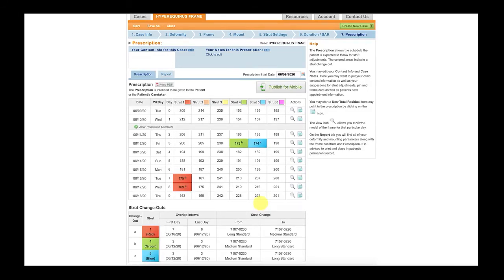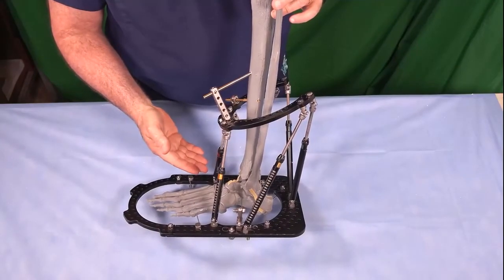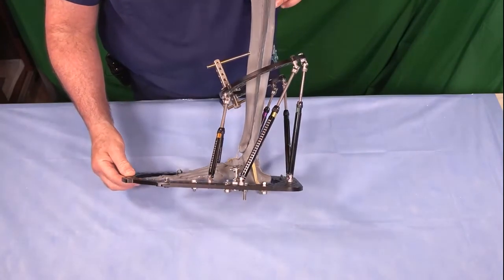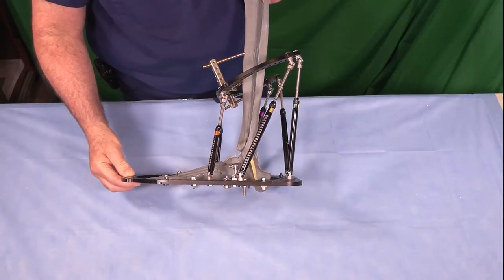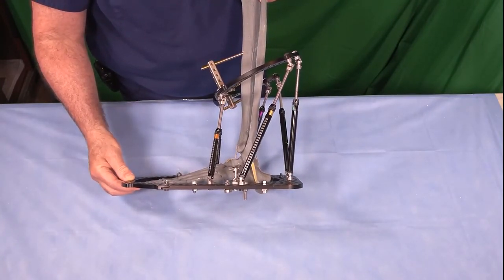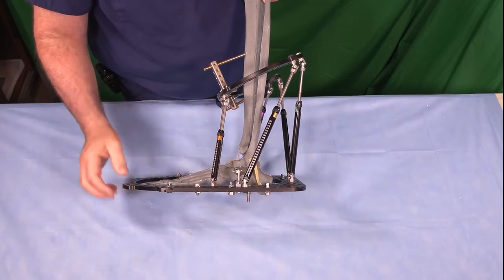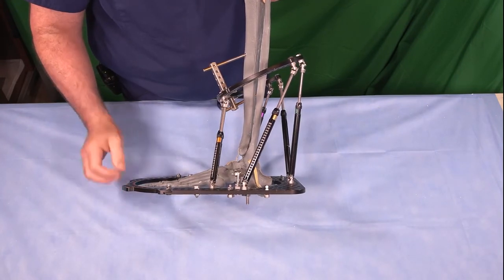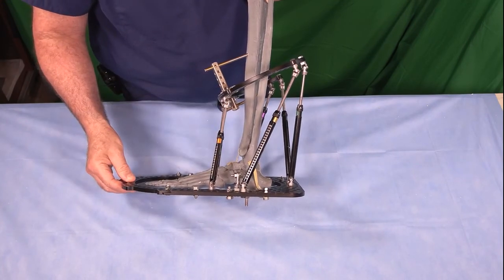So now we're going to take these final numbers and the strut changes, and I'm going to go back to the Sawbones lab and apply these numbers and do these strut changes, and let's see what we get. I've just completed the correction based on the program, and if we look at the lateral view, we can see that we've corrected the foot to a neutral position, but that's not really good enough. We want to overcorrect it to beyond neutral. So what I'll do next is run a secondary program, a residual program, and get the final correction where I get this 15 degrees turned up.